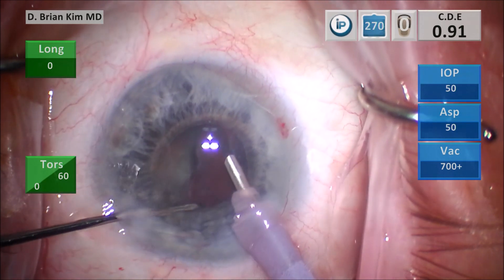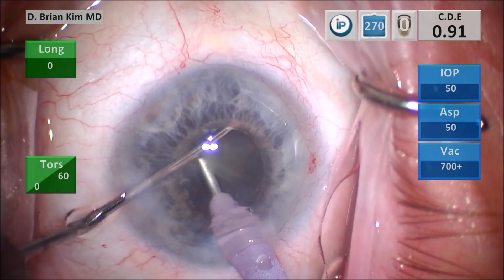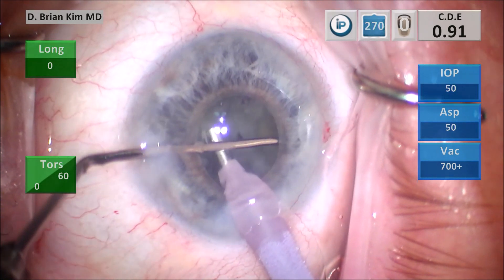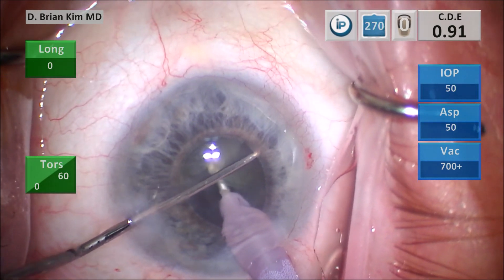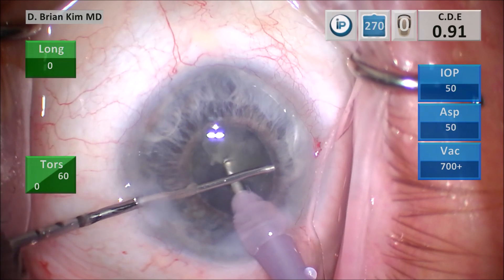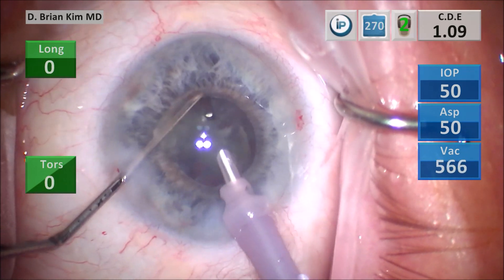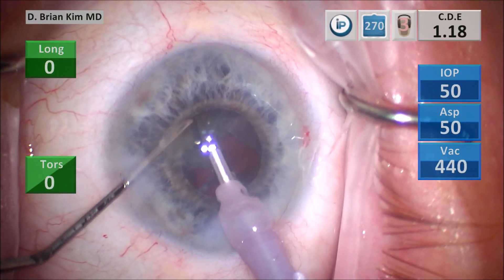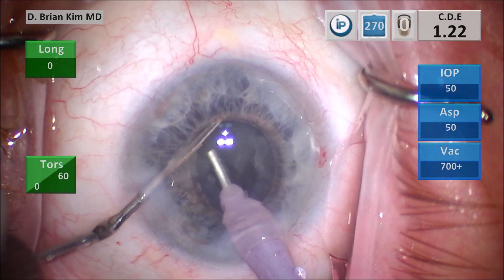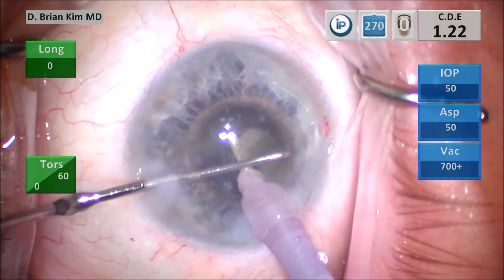I'm gently rotating the second hemi-nucleus in front of me. Place the chopper out to the equator, place the phaco tip deep in the back, crushing the lens completely in half, creating the third and fourth quadrant. I'm placing the chopper around the third quadrant, crushing the lens piece against the phaco tip — the third quadrant was mobilized into smaller pieces and I'm emulsifying. This is the fourth quadrant: placing the chopper out to the equator, pulling it centrally, crushing the lens piece against the phaco tip, and then emulsifying. All of the endonucleus is out now.